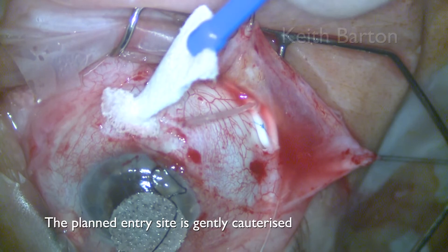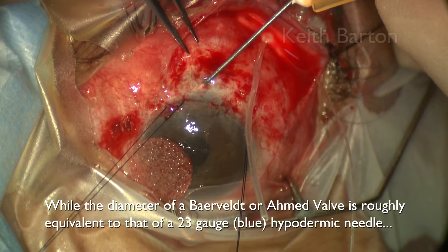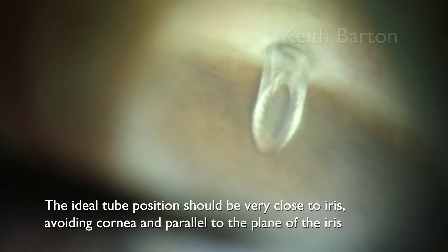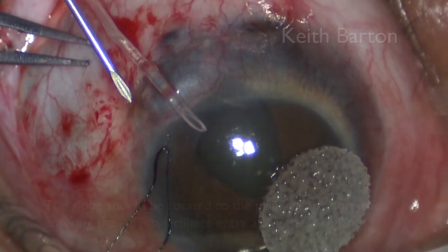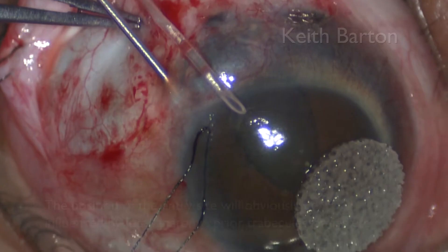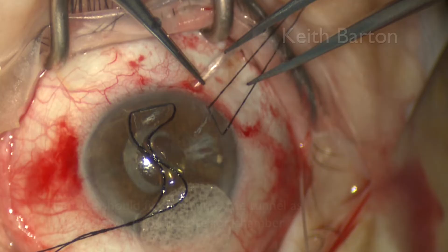The planned entry site is gently cauterised. While the diameter of a Baerveldt/Ahmed valve tube is roughly equivalent to that of a 23-gauge or blue hypodermic needle, a 25-gauge or orange needle is safer when the entry site sclera is thin as seen here, reducing the risk of peritubular drainage. The ideal tube position should be very close to iris, avoiding cornea and parallel to the plane of the iris. Contrary to popular belief, a tube resting on the iris does not cause uveitis except in exceptional circumstances, but is less likely to damage corneal endothelium. The globe should be rotated to the primary position when entering the AC to facilitate entry along the iris plane. The tube should fit snugly into the tunnel as it is fed slowly into the anterior chamber.